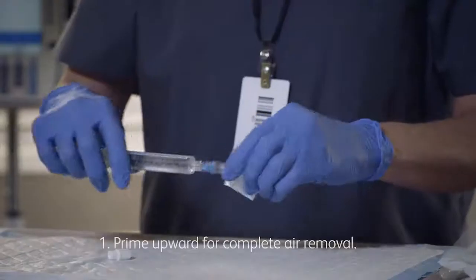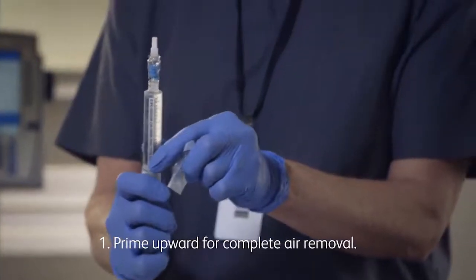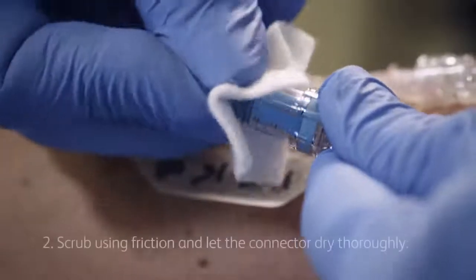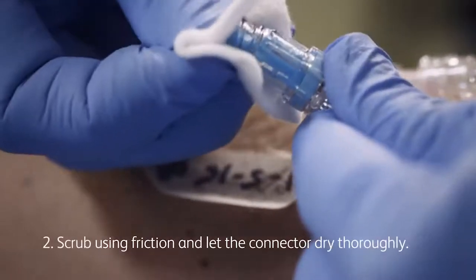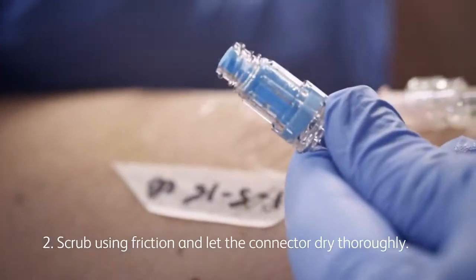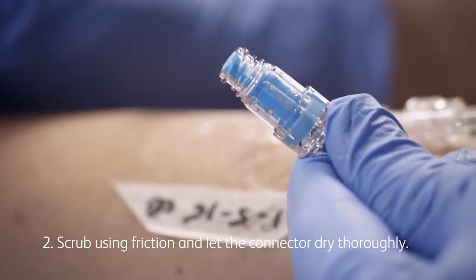Please consider the following reminders as you incorporate the MAC-Zero into your IV bundle. One: Prime upward for complete air removal. Two: Scrub with friction for 3 seconds or per hospital protocol and let the connector dry before every access.